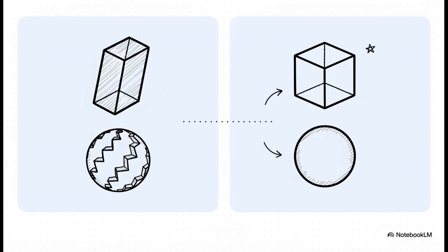Maybe 0.5 by 0.5 by 0.5 millimeters. This gives us perfectly sharp, beautiful 3D reconstructions. And anisotropic, though, that means unequal. The z-axis is thicker, turning it into a long rectangle. And that uneven shape is exactly what causes those jagged, ugly stair-step artifacts when you try to look at the scan from different angles. Just remember, ISO equals equal.